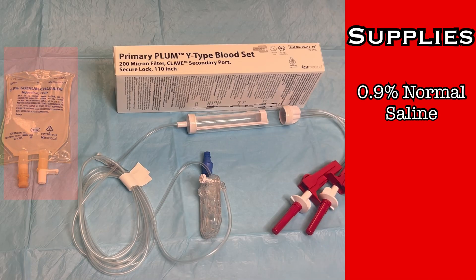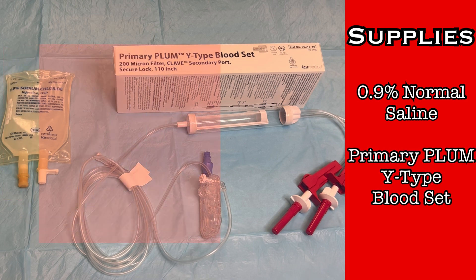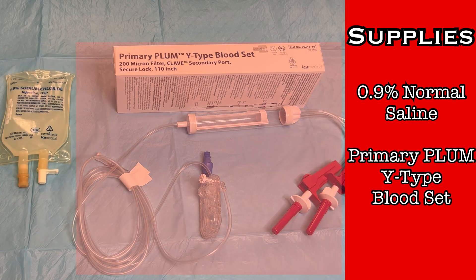All you will need is a small bag of saline — a small volume bag such as 100 milliliters or 250 milliliters is all that will be necessary for a blood transfusion. Normal saline is the only IV solution suitable for transfusion of blood products. For tubing, you will need a primary Plum Y-type blood set.